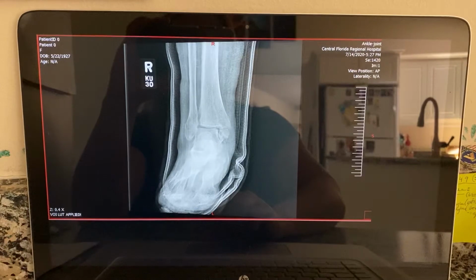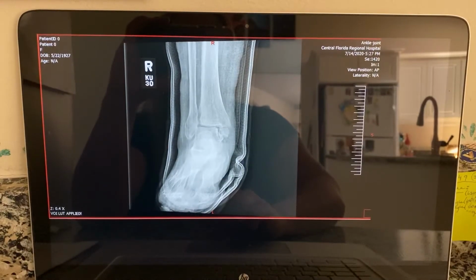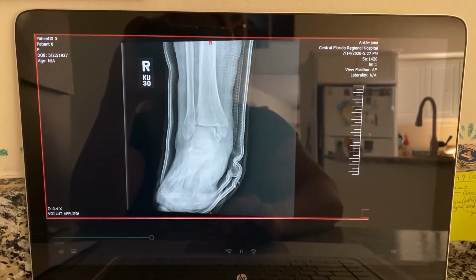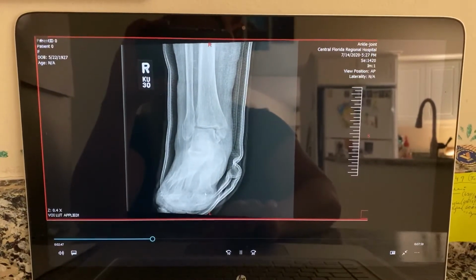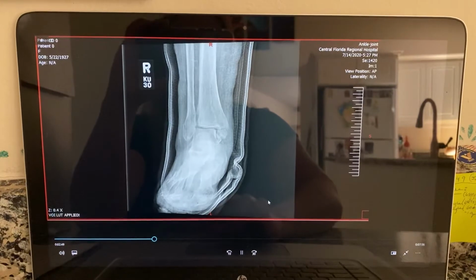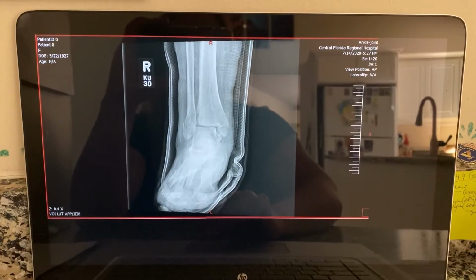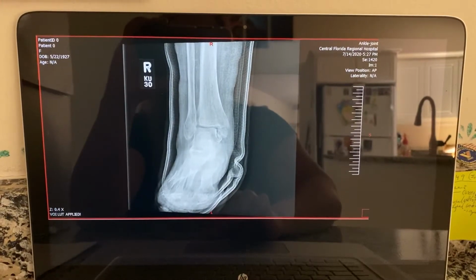However, the patient was unable to obtain a true AP position with her toes pointing upwards and the plantar surface exactly vertical. The patient was rolled onto her left with a wedge sponge placed near her right hip to try to obtain the best AP position for her condition.